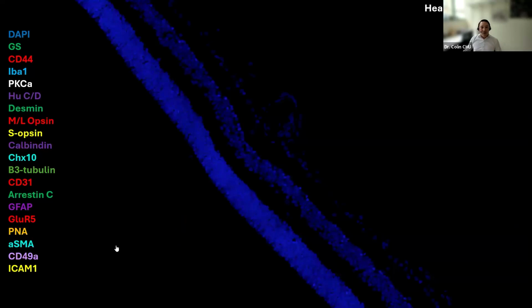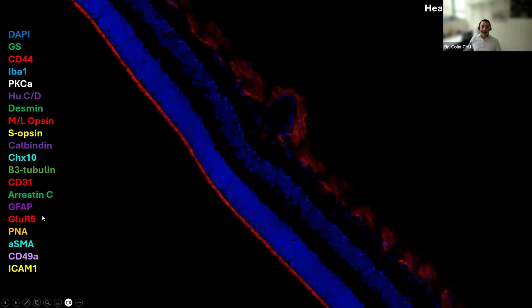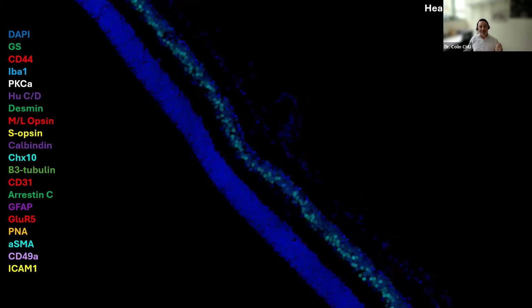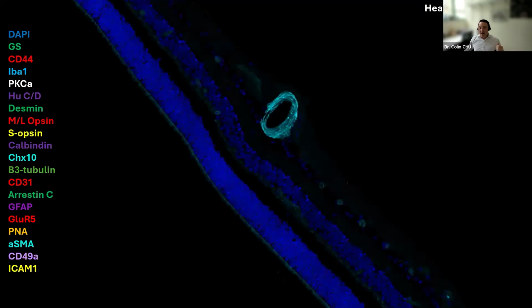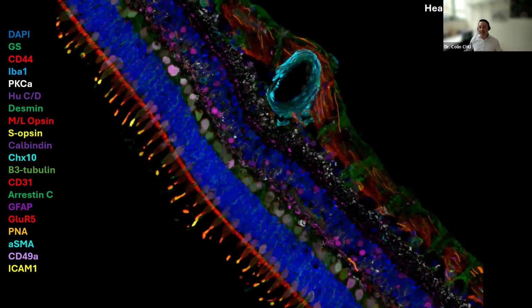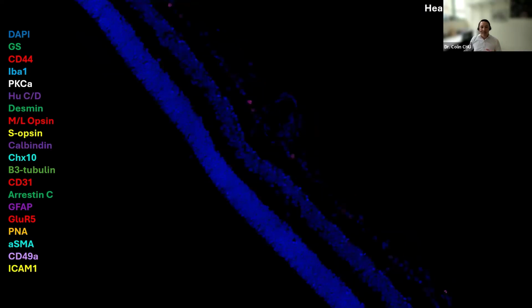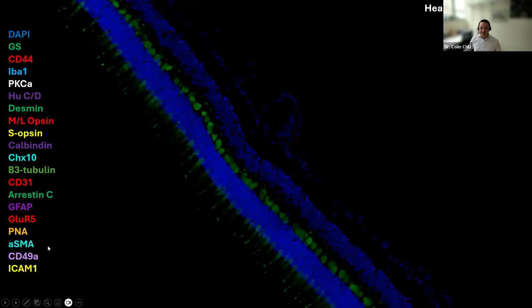And similarly, we've also done work in the retina now in our lab. And so this is, let me just play this. This is human healthy retina, where we just cycle through a single marker. This was done manually on a confocal, but just showing you with a relatively modest number of markers, how this could be any of your tissues of interest, that you could reconstruct almost the entire tissue microenvironment. And that's particularly important here in health to see the layers and the positions of all the different cells, but it's even more critical in many other applications, particularly when you perturb the system.